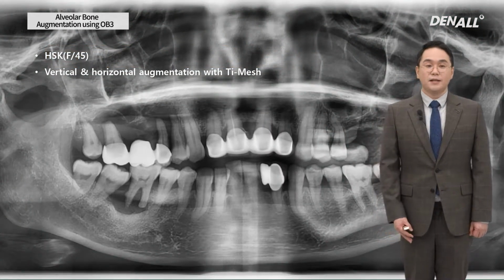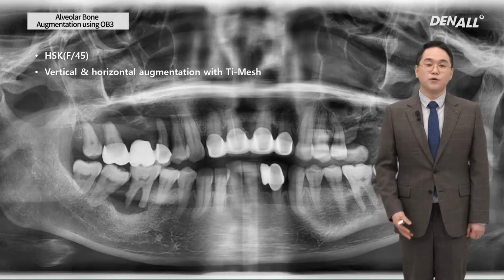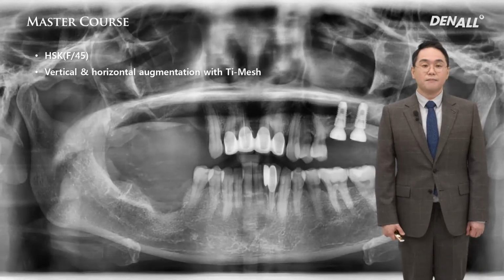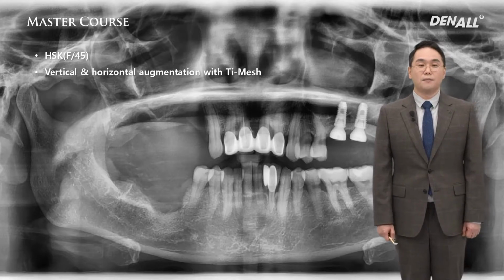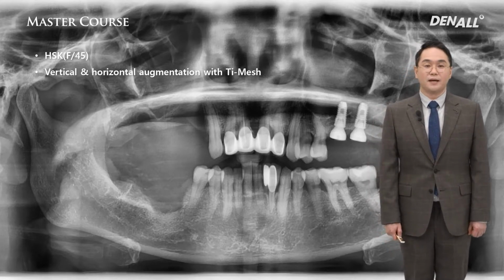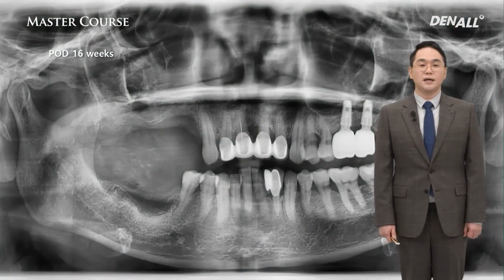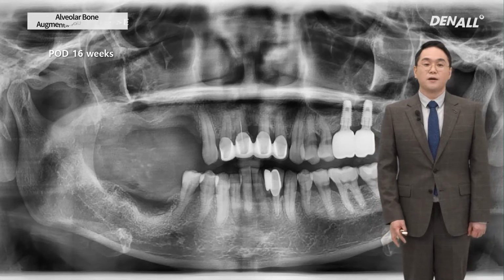45-year-old female, chief complaint due to severe periodontal disease. Overall, there is teeth mobility and a defect at number 26 and 27. First, the upper right posterior teeth are extracted due to severe mobility. Waited until soft tissue healing. In the meanwhile, 2 implants are placed at number 26 and 27. And prostheses were delivered after occlusion is established in the left posterior.